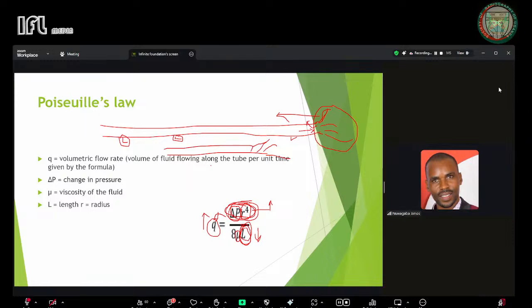Compared to that, if you see where the blood is going, it is going to the placenta, which is like a flat tissue, and there are not many dividers, and that is going to cause less resistance at the placental side compared to the fetal side, where the umbilical arteries are coming off from many little branches that reflect that high resistance. So it is all about where you are coming from and where you are going.